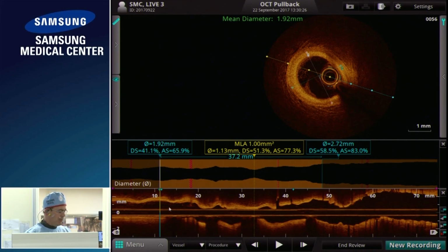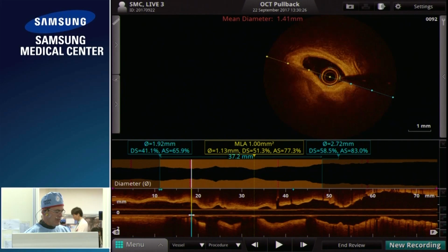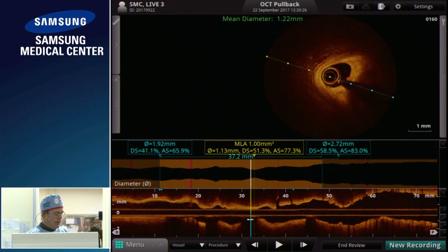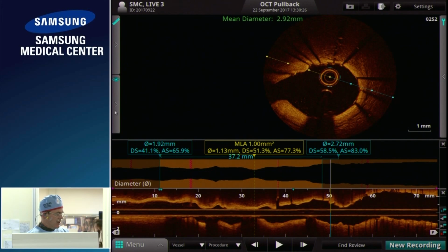Now, if we look at the lumen profile here, the MLA, and I'm going to show you the axial view, there's a bit more atheroma here. There's another tight lesion here, which is eccentric. That's the distal focal lesion you see projected in that PA cranial view. But look at this lesion. This is really a very tight lesion, soft fibroatheroma, and then we're coming into the distal end of the stent.